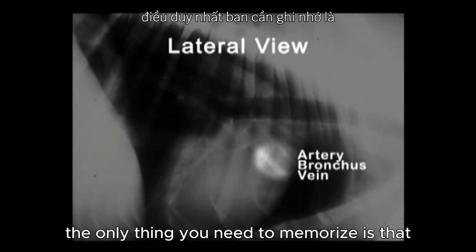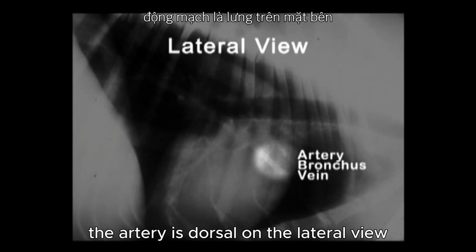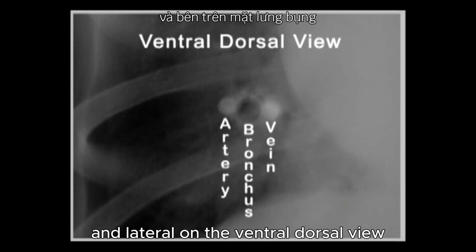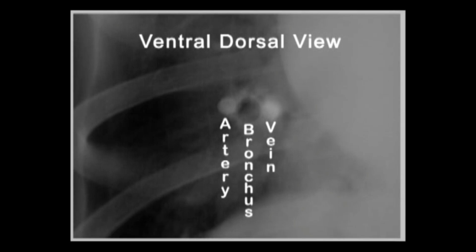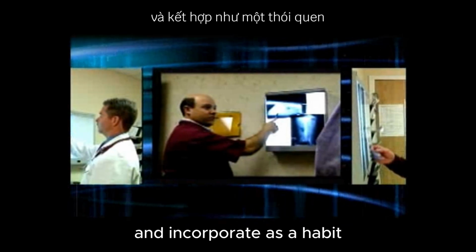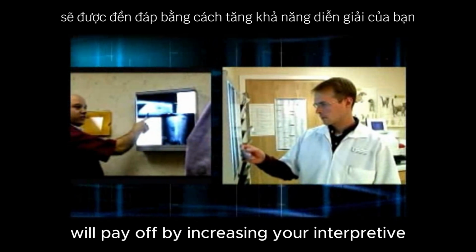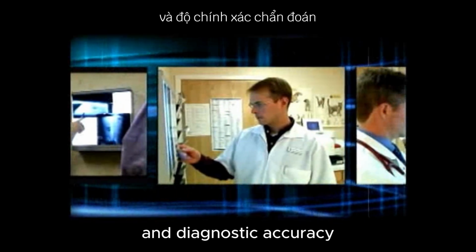The only thing you need to memorize is that in the artery-bronchus-vein triad, the artery is dorsal on the lateral view and lateral on the ventrodorsal view. This systematic approach will take some time to learn and incorporate as a habit. Doing it, however, will pay off by increasing your interpretive and diagnostic accuracy.